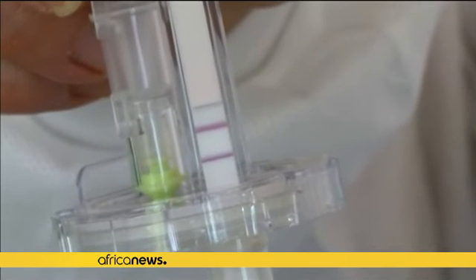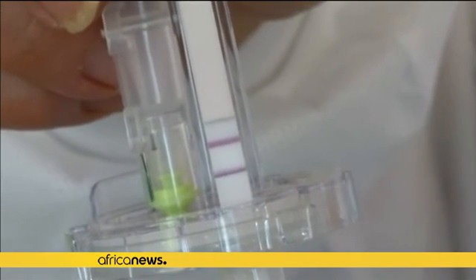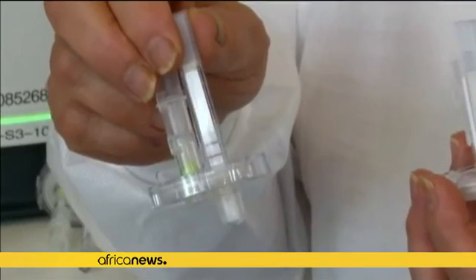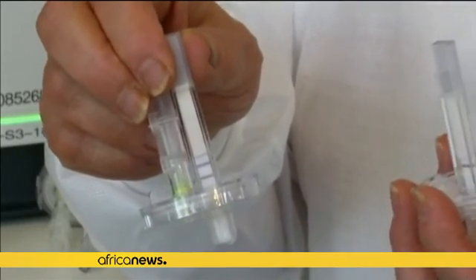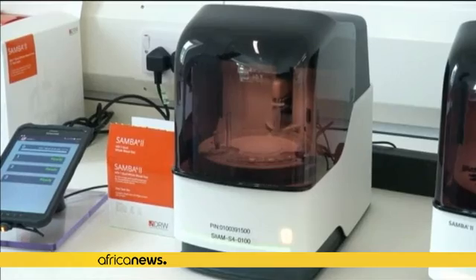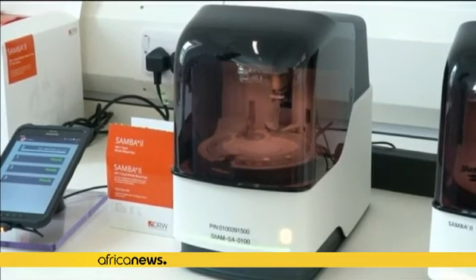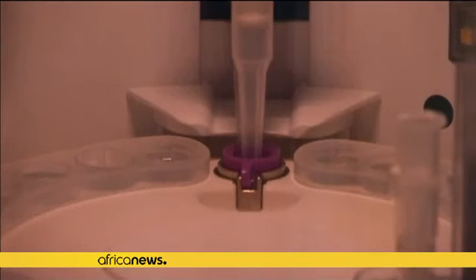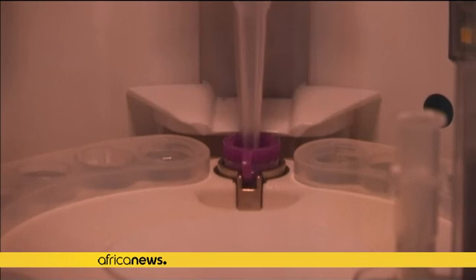The introduction of the machine brings with it the delivery of accurate results without the need for reagent refrigeration, thanks to innovative freeze drying that allows the test kit not only to remain stable at room temperature, but also withstand heat up to 55 degrees centigrade.